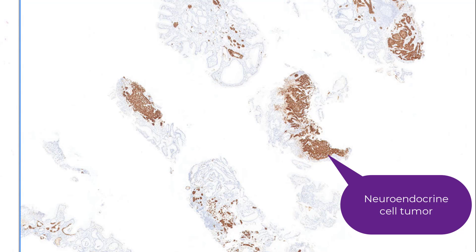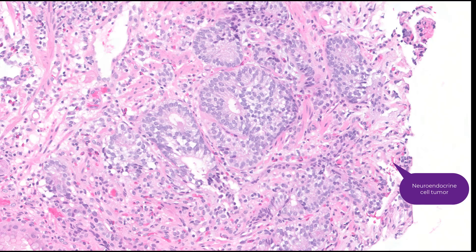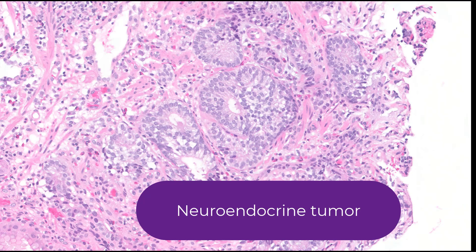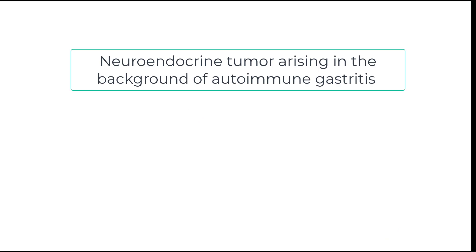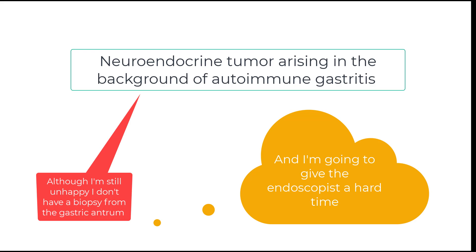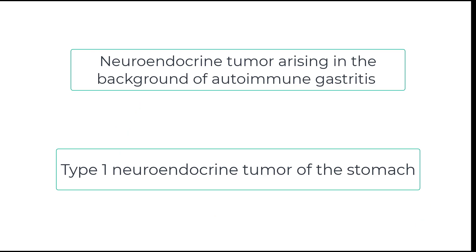By definition, a neuroendocrine tumor should measure at least 0.5 millimeters. At a very practical level, if an endoscopist sees a nodule — which this endoscopist did see — and a good proportion of that nodule is neuroendocrine, I call it a neuroendocrine tumor even if it is less than 0.5 millimeters in size. Here's a closer look at that tumor — clearly very monotonous, chromogranin positive, and they often show this gland-like phenotype, not to be mistaken for an adenocarcinoma. This is a neuroendocrine tumor arising in the background of autoimmune gastritis, which places it in the category of a type 1 neuroendocrine tumor of the stomach.